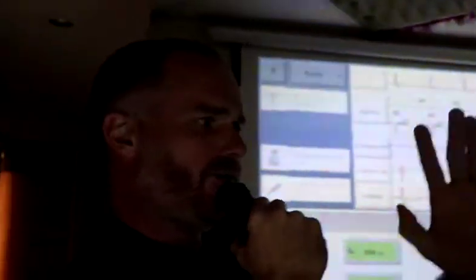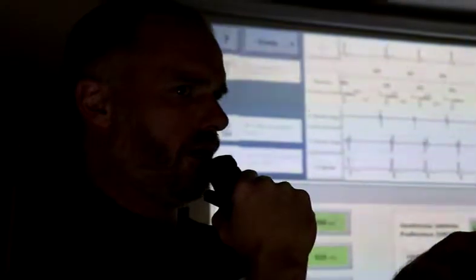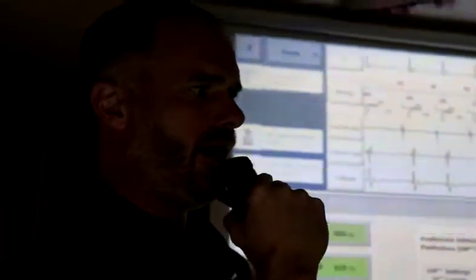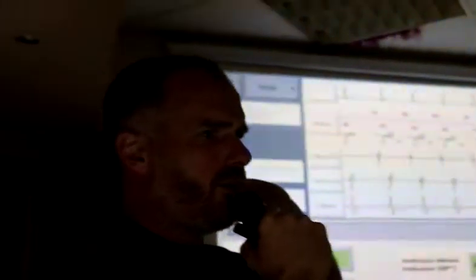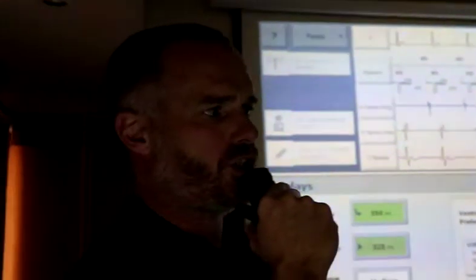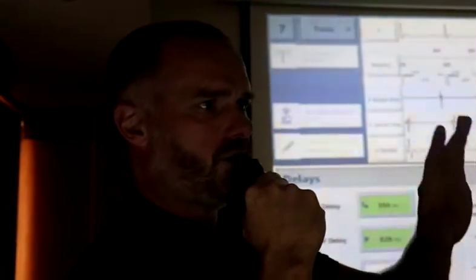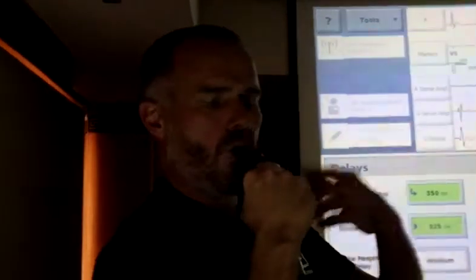So, yeah, absolutely. If you go very long AV delays, a fixed long AV delay, you've got very long first-degree AV block, right? Which can induce heart failure symptoms. If we did that, when we paced, we would have a ton of mitral regurgitation, tricuspid regurgitation, and the patient might not feel great. So the idea of VIP is when they pace, they get more physiological AV delays. When they have intrinsic conduction, we let it go.